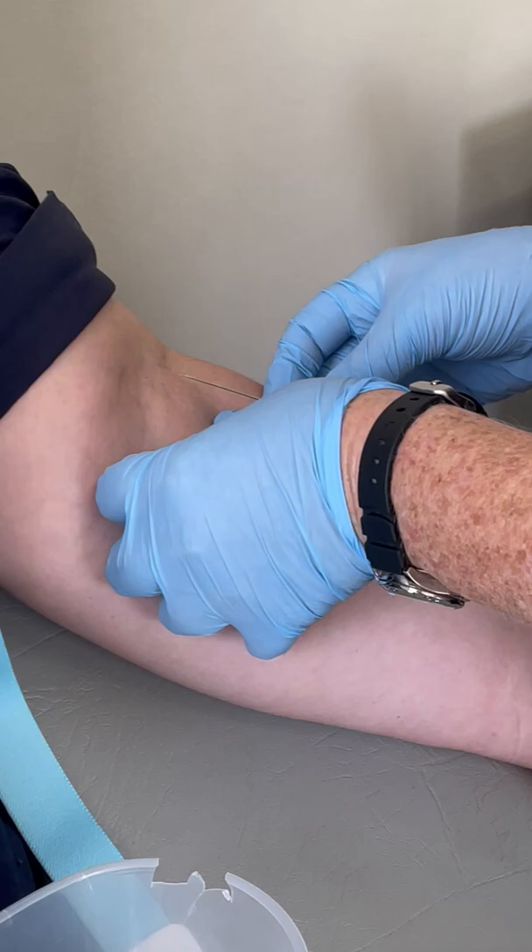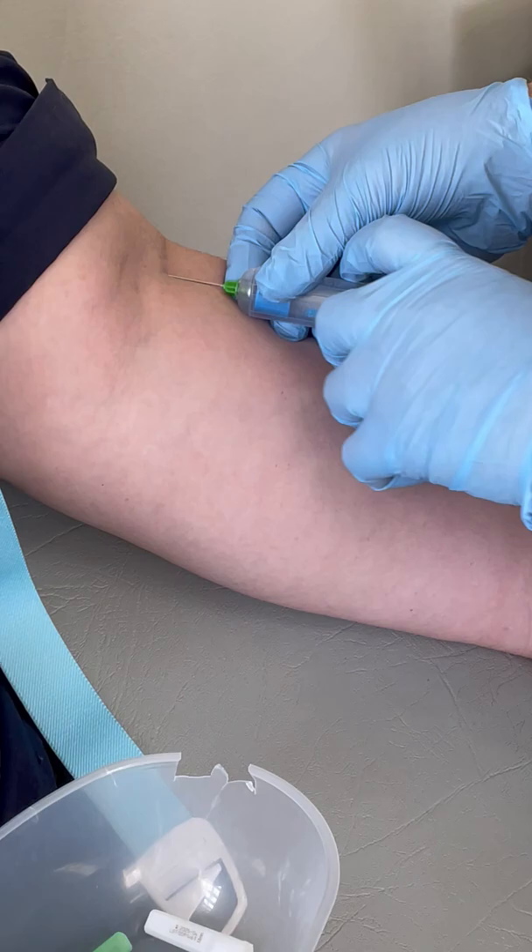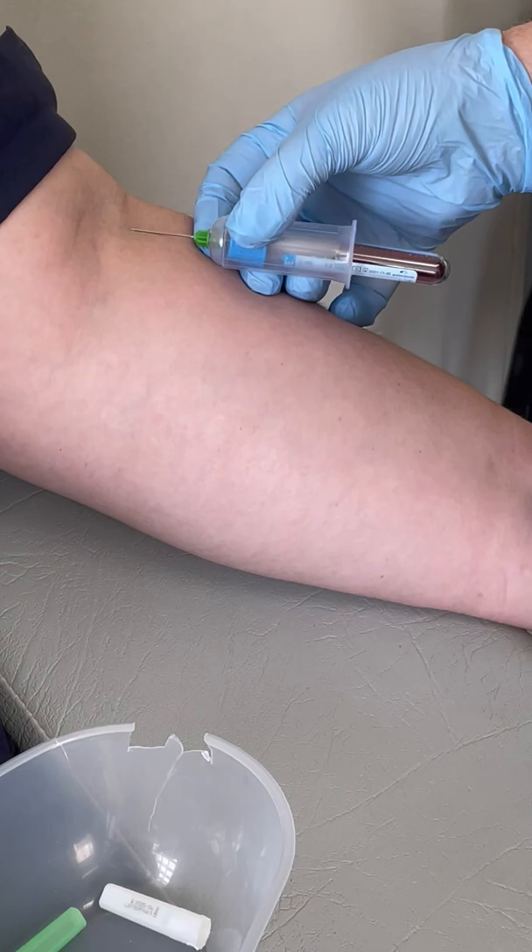Bevel up. Insert the needle swiftly and pop your tube on. You can see that the label of the tube is not obscuring the view, so you can see that the tube is actually filling with blood.